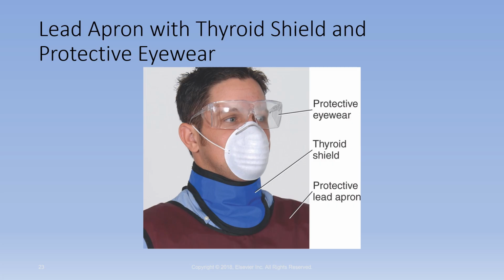Shielding, not in the way we normally think of patient shielding, but you want to follow all shielding precautions by wearing your lead apron, making sure that the lead drape shield is on the fluoro tower. The Bucky slot shield is enacted by moving the Bucky all the way to the foot of the table, and wearing your lead gloves if they're needed or if the radiologist needs them.